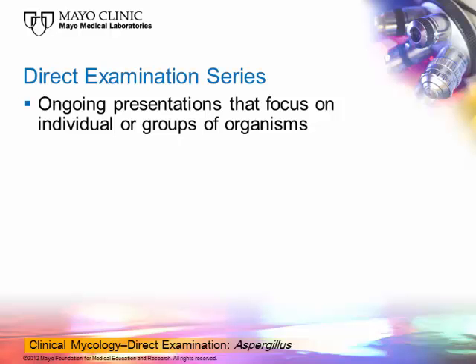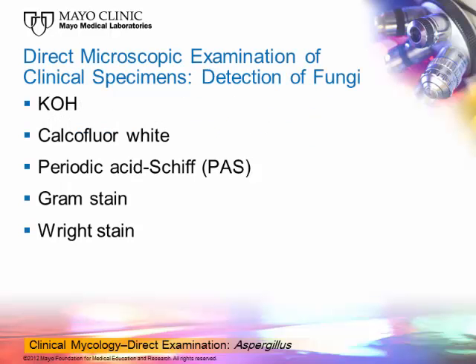This is an ongoing presentation that focuses on the individual or groups of organisms as seen using direct microscopic examination of clinical specimens. It allows us to see the fungi before a culture actually can be done, and oftentimes we can make the diagnosis early.